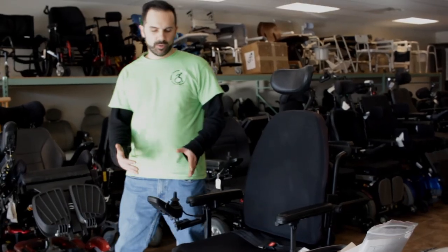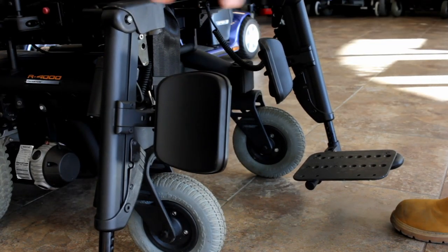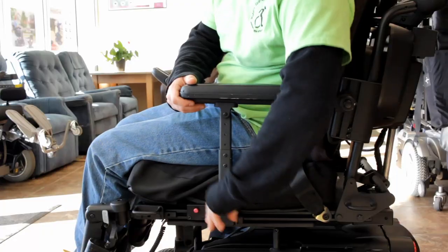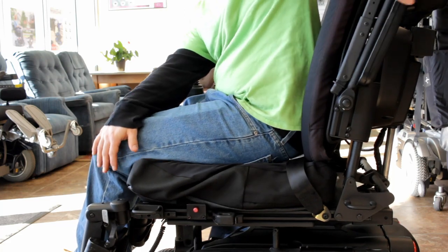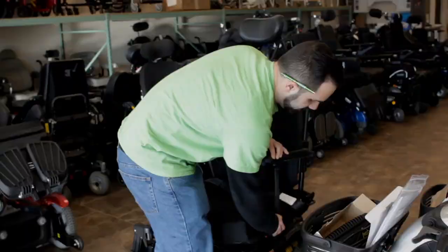This chair is also equipped with swing-away leg rests right here for easy transferring. Another quality for easy transferring is the flip-up armrests that allow the user to get in and out utilizing certain vantage points.